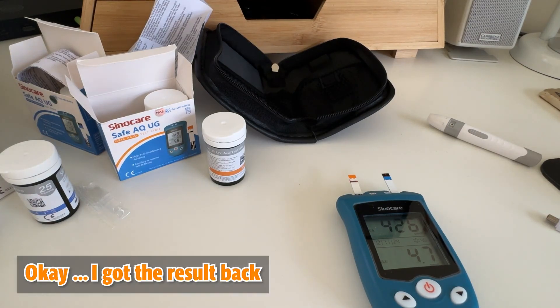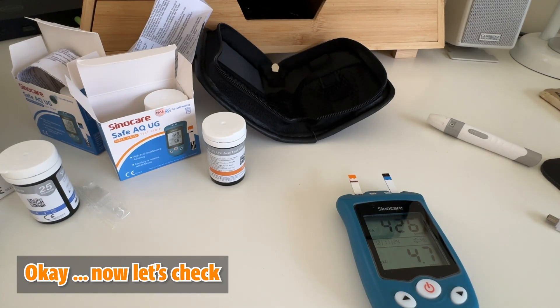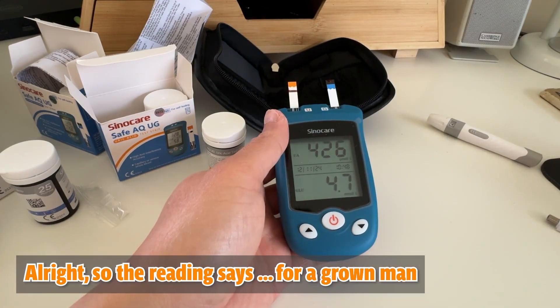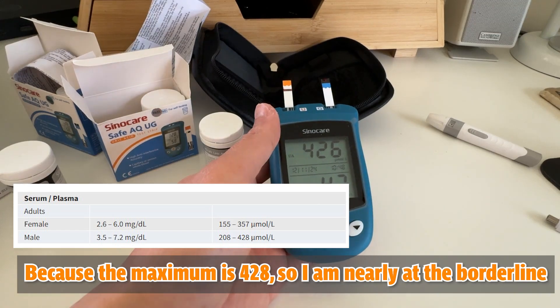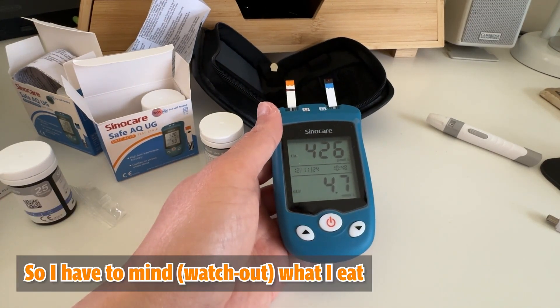Okay, I got the result back. Now let's check. The reading for a grown man is 428. It's still within the acceptable range because the maximum is 428, so I'm nearly at the borderline. I have to mind what I eat.